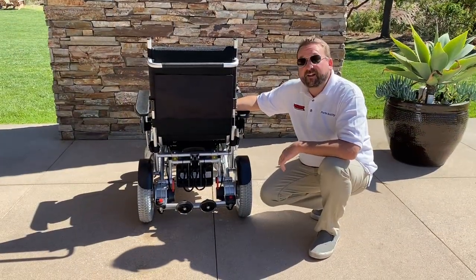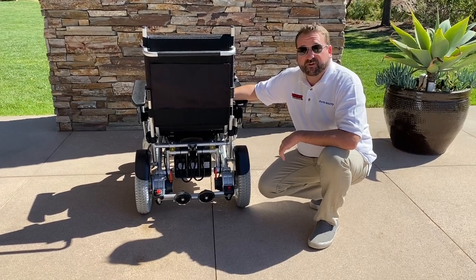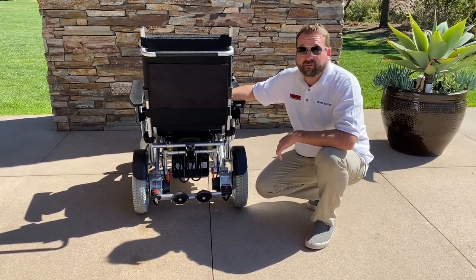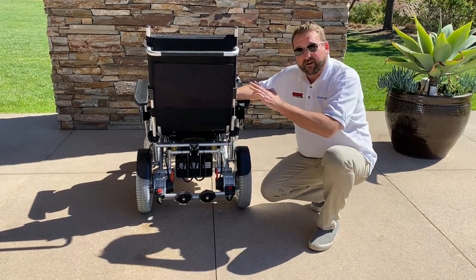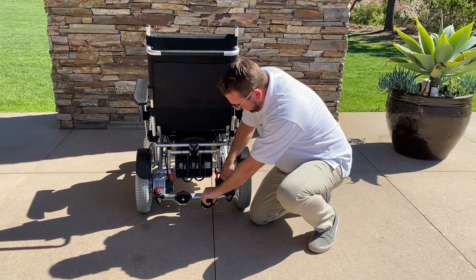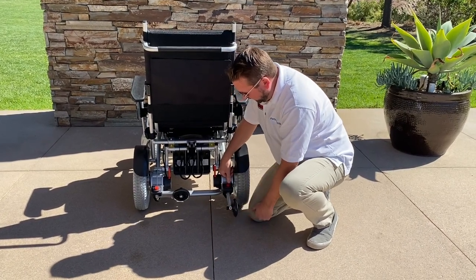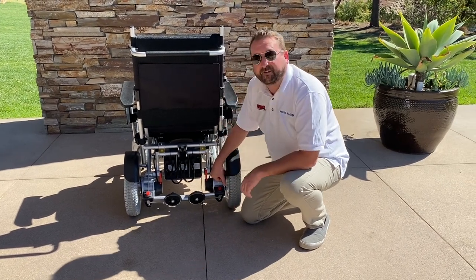Now I'm going to explain some of the advanced features that the Beast has. First, there are the anti-tip wheels, which are great for when you're going up inclines, hills, or ramps. They're really sturdy and provide smooth inclines. They extend by simply pressing the red button and extending them out, and retract by pressing the red button again — they retract on their own.